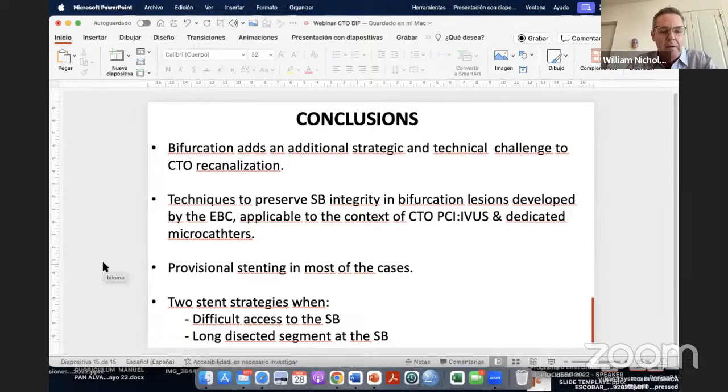It was obviously, these are very challenging cases. I think when the side branch is at the proximal cap, it's really not part of the CTO, and so it's often not an issue whatsoever, like you had said. I'm curious, when you are in the true lumen distally in the main branch, and you have a flap across the side branch, and you've lost visualization, how do you approach that?